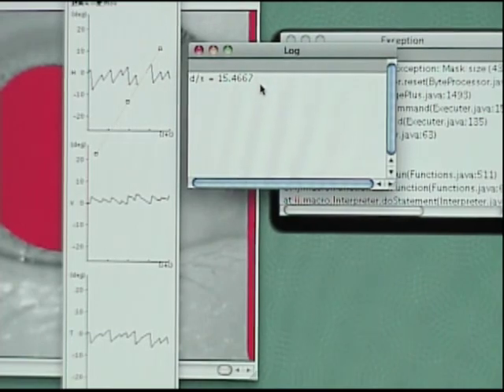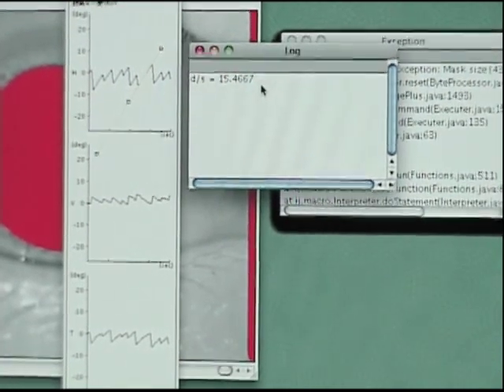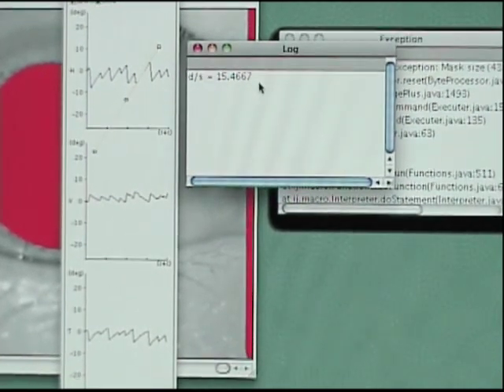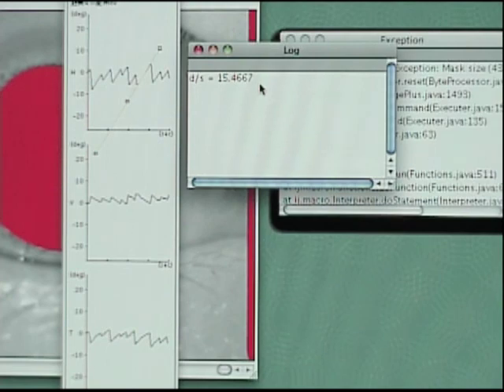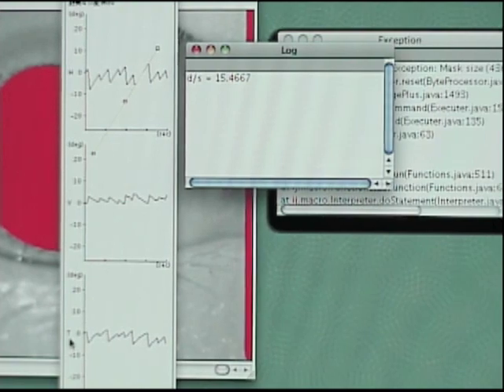In the same way, we can know the slow-phase velocity of vertical component and torsional component.